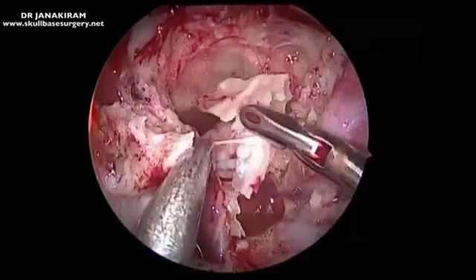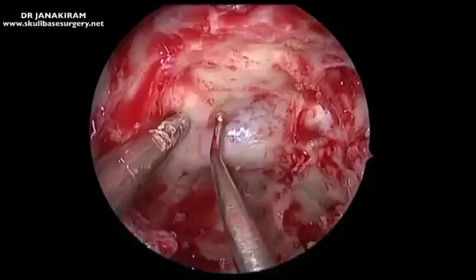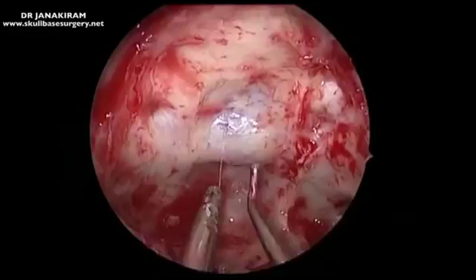It is a brilliant exposure from optic to optic. These are the structures in the sphenoid sinus — that is the planum sphenoidale, bounded anteriorly by the posterior ethmoidal artery and posteriorly by the roof of the optic canals. You can now see the lateral optico-carotid recess and the clival recess.